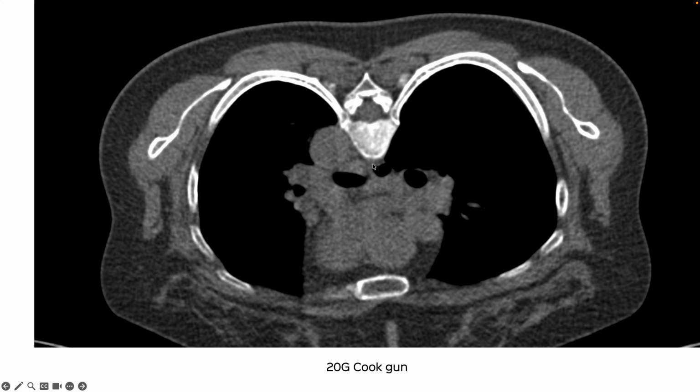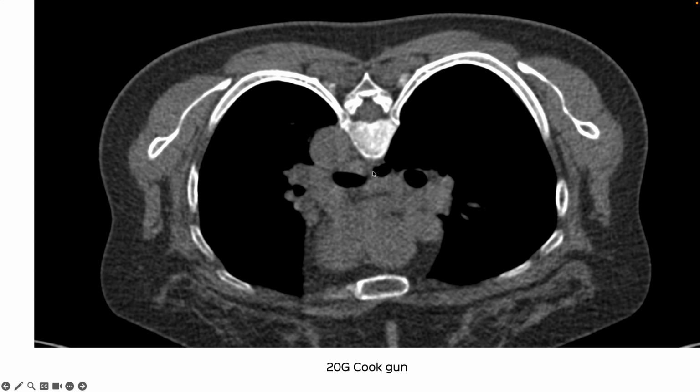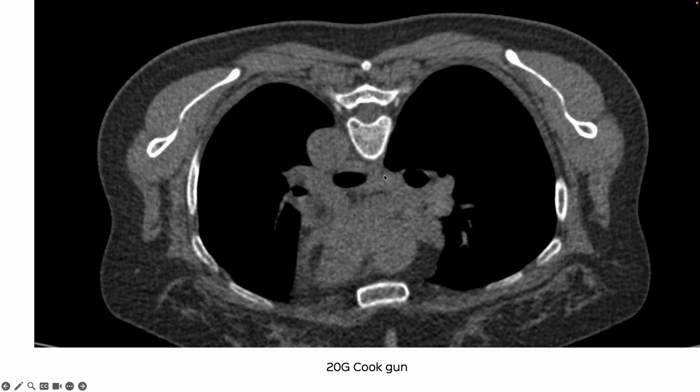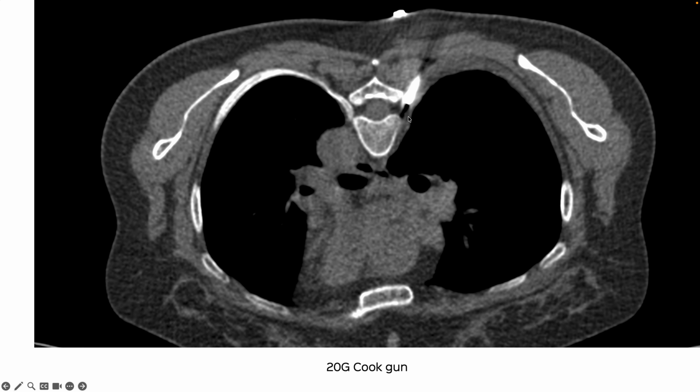So here is the subcarinal node. I couldn't see it very well initially, so I did a 7.5 degrees craniocaudal angulation. So now there is a clear path to the lymph node. So using a 20 gauge Cook needle, I placed it first next to the foramen, injected local anesthetic.